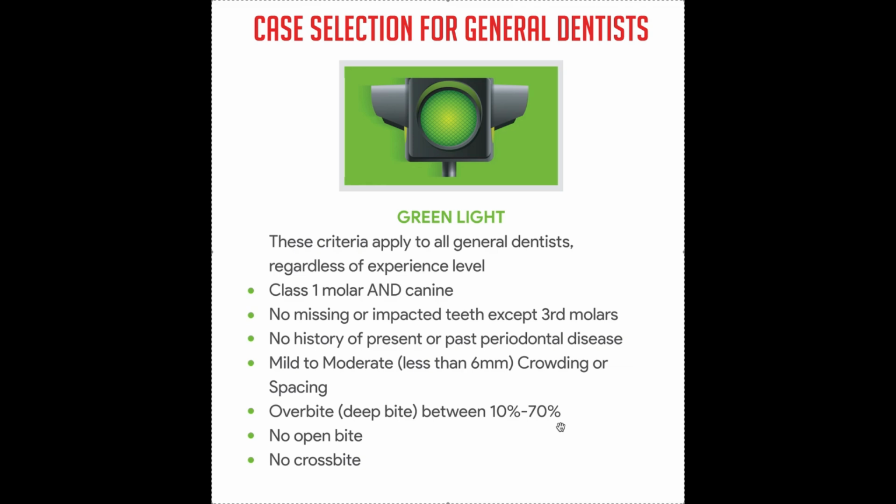If there's any type of anterior open bite at all on any of the front teeth, it's a no. You've got to have some overlap on all 4 of the front teeth. So not a severe deep bite case and not even a tad of an open bite case. Pretty normal vertical, okay? No open bites. Also, no cross bites of any form. No posterior cross bites, no anterior cross bites. Everything is perfect in terms of the interdigitation of the back teeth. You get the idea, okay?